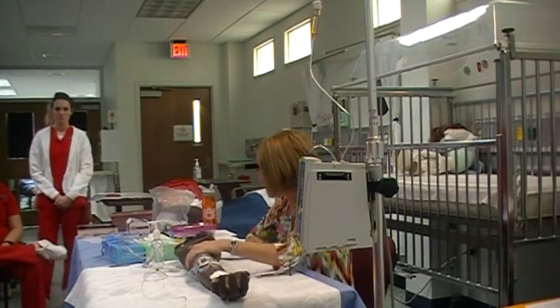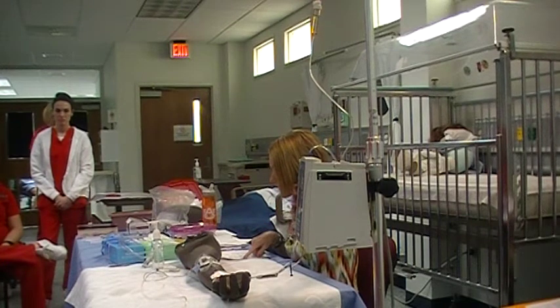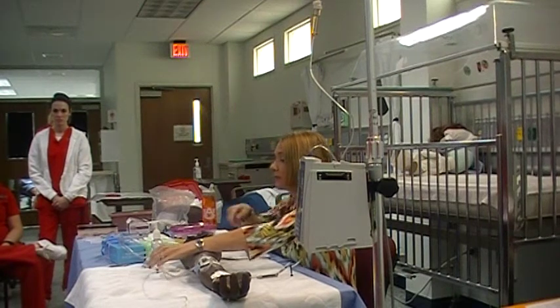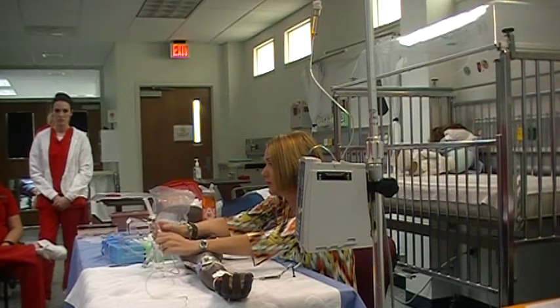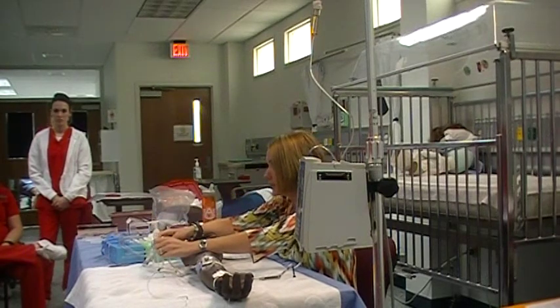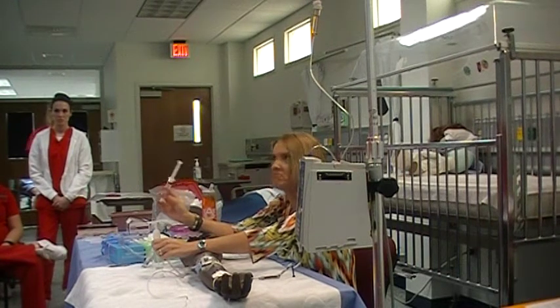If we're incompatible, you would go to that section of incompatibility where you would stop the fluid, select the port closest to the patient, flush the line with a full 10 cc's. That's the 10 mLs. That's the most important. So you're going to flush with 10 mLs before you give your medication. Now this 10 mLs, does it have to be at a certain speed? No, the first one, no.